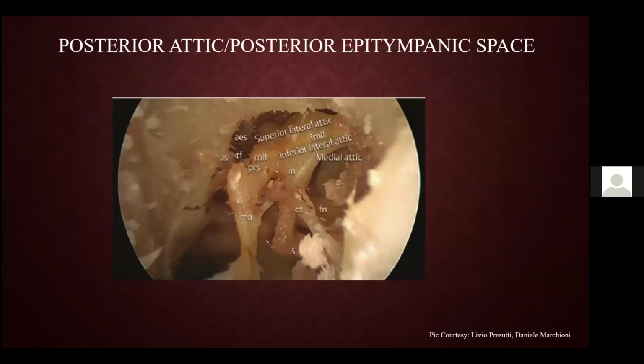We'll discuss in the coming slides. So let's see this endoscopic picture. You can see that the part of the scutum is removed here, and the lateral incudomalleal fold, which is also removed, but you can see a faint line and the marking here, and the lateral malleal fold.